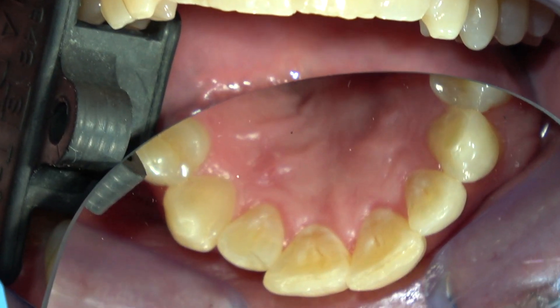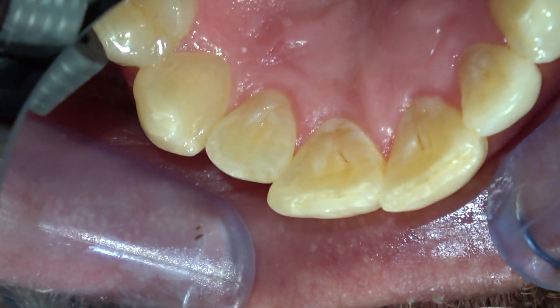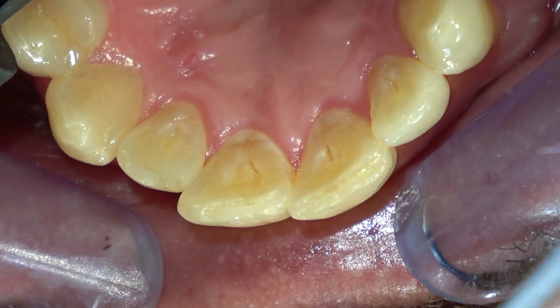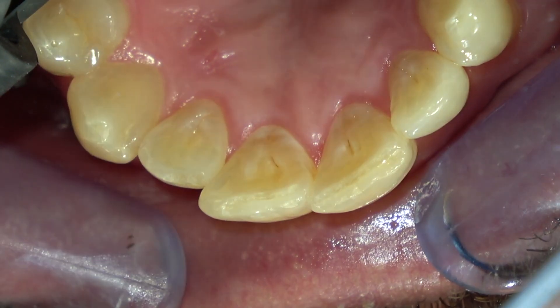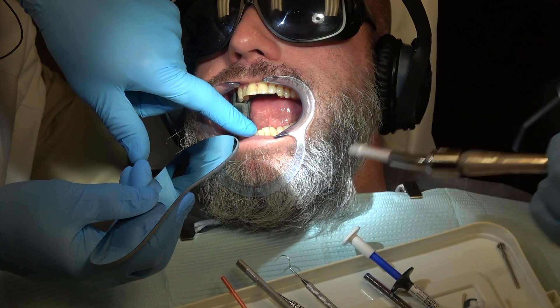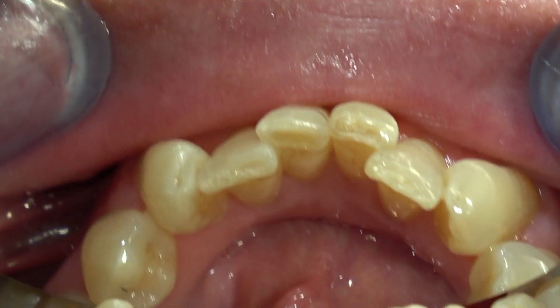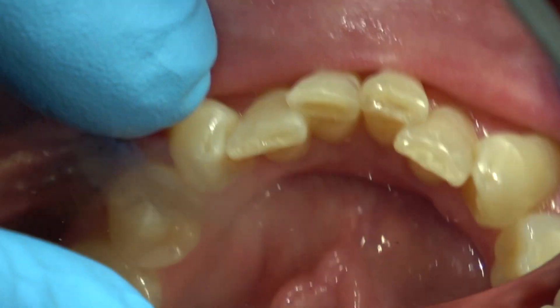If you look at these incisal edges of the maxillary central incisors, you can see he's worn the teeth into the dentin. They've got these odd shapes, but they mesh perfectly with the lower anterior teeth, where he's done the same thing — you can see how he's worn those into the dentin of the teeth as well.